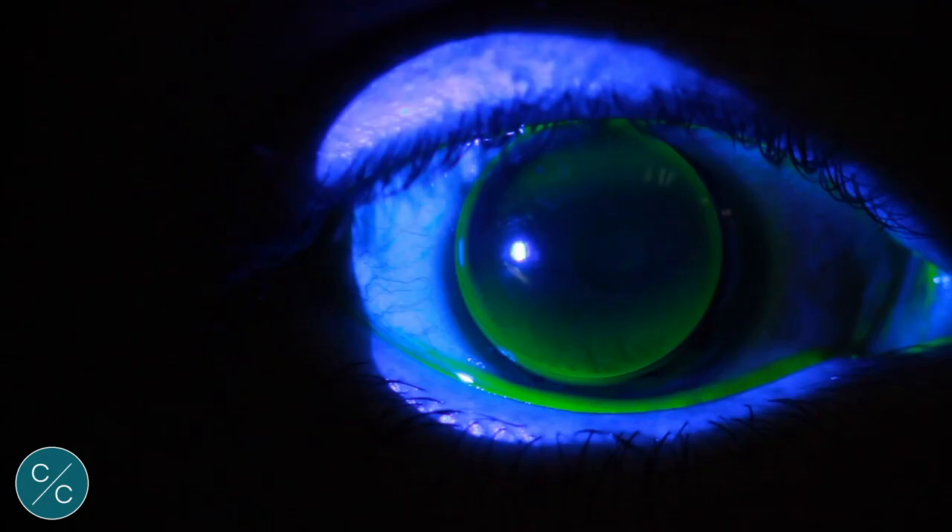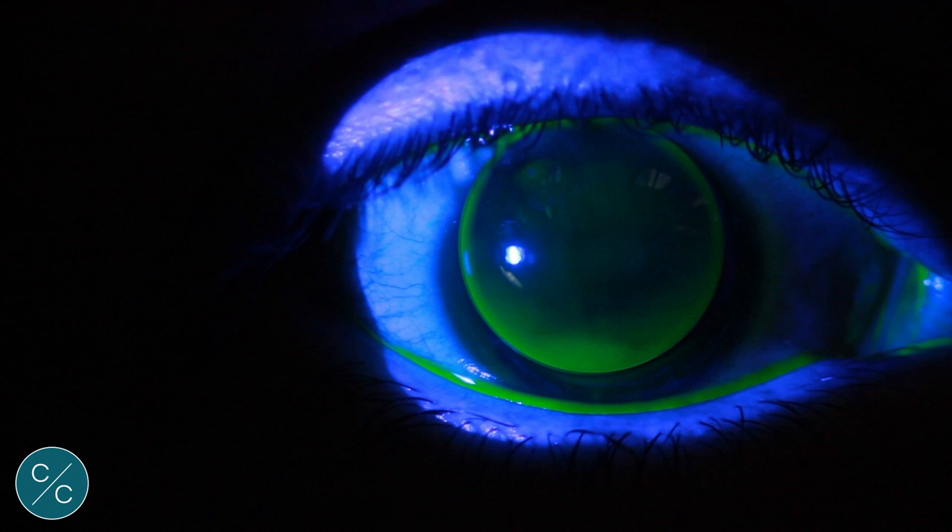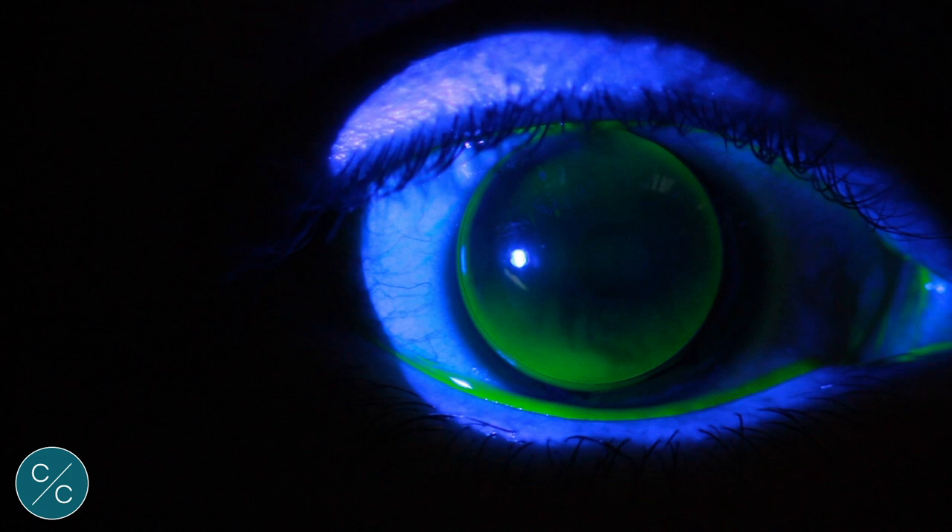Here's our 8.10 lens on the eye and we can immediately see that this is nothing like the suggested image. The lens is clearly loose — we have excessive clearance top and bottom, and with the blink the lens wants to rotate around the axis rather than across the centre. Clearly this lens isn't going to be comfortable and we'll need to tighten it.